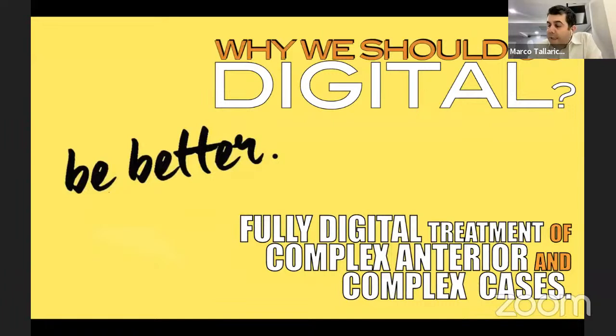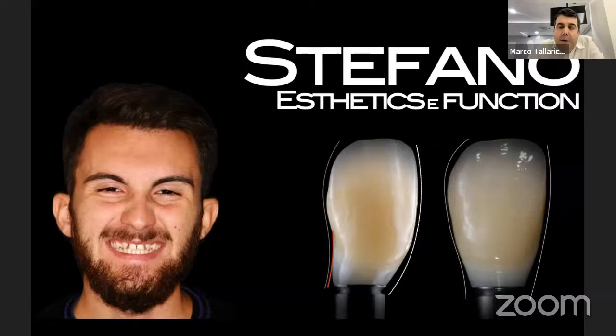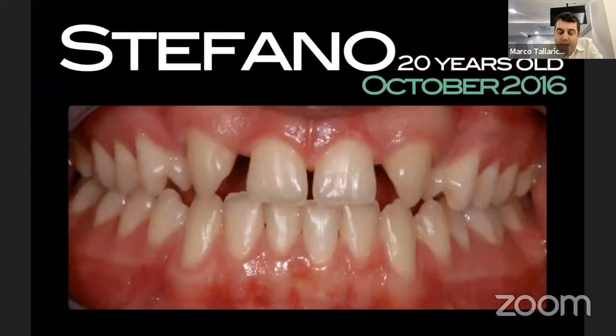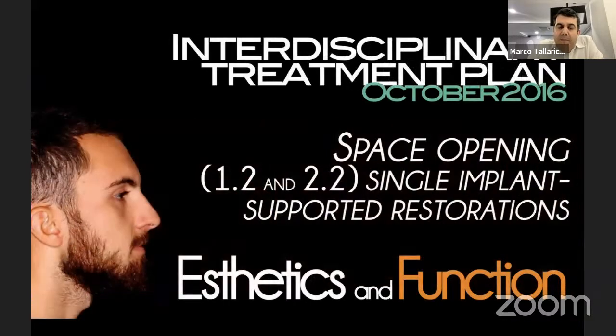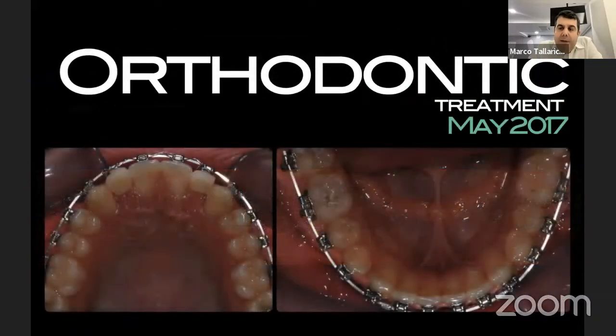So I want to move in the last maybe 10 minutes on some cases with implant and digital anterior and complex cases. This is Stefano. He needed two upper lateral incisors because he has an agenesis, but he needs orthodontic treatment. So after orthodontic treatment, we plan space opening in the lateral position. The case started 6 years ago.